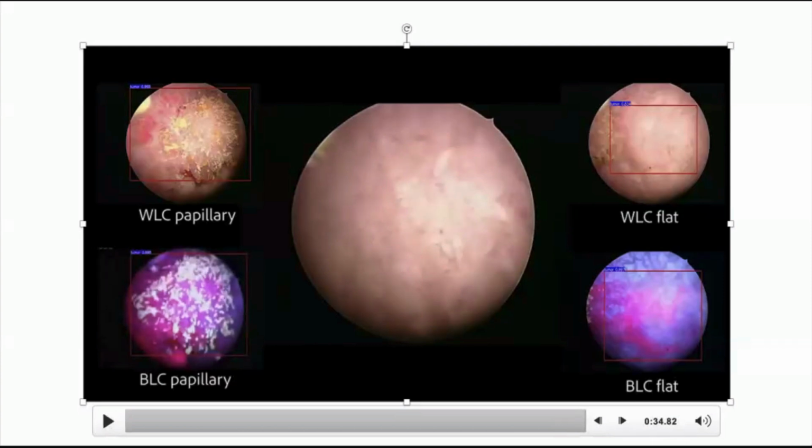So this video demonstrates a couple of interesting things. First off, notice how it can actually annotate multiple different parts of your image at the same time. So even if you have 2, 3, 4 tumors, it would individually segment all of those and demonstrate them all in real time to you. But the other thing is that it works seemingly for blue light cysto, even though it was never trained on blue light cystoscopy images. And that does raise an interesting thought.